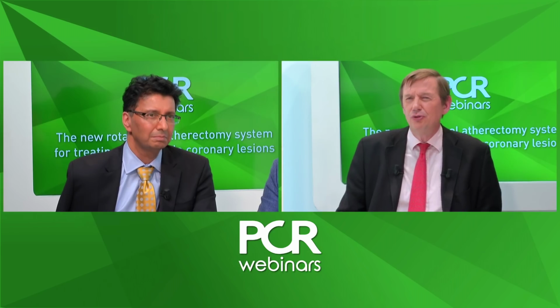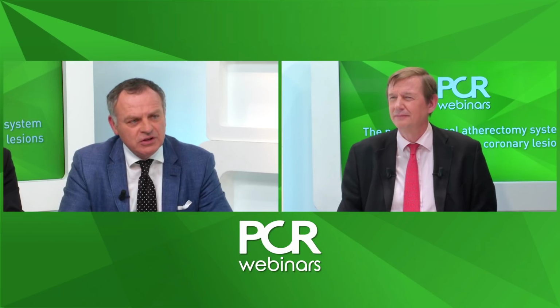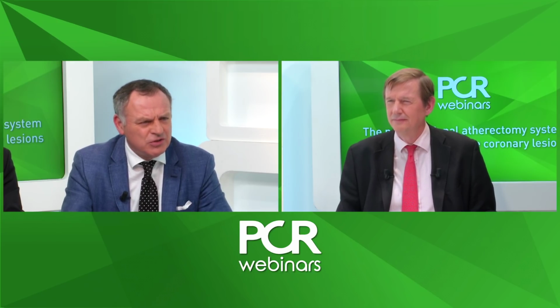And understanding the fragility of the wire, we've developed some techniques to reduce the chances of running into problems. Bruno, perhaps you could share some ideas about that. Well, you are perfectly right, Adam. When you face some tortuous anatomy or some difficult angulation to handle, then you can use your standard wire and exchange on the microcatheter for the rota wire. I think that more and more, when you want to use the rota wire and you have to face some difficult anatomy, do not hesitate. Use your standard wire, use a microcatheter, and then exchange it for the rota wire.